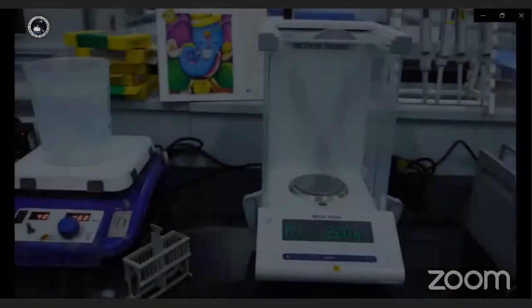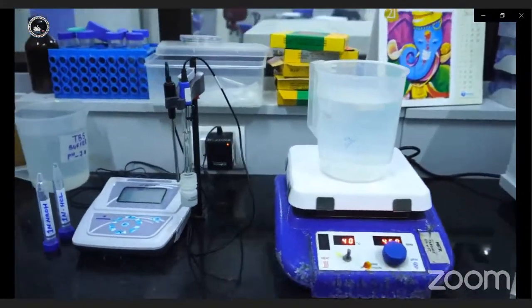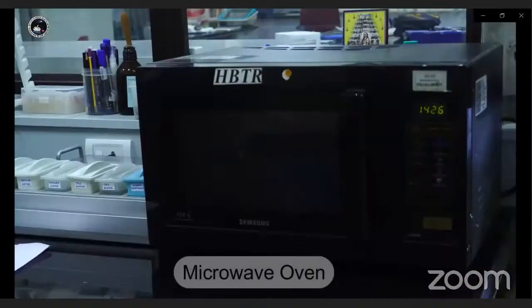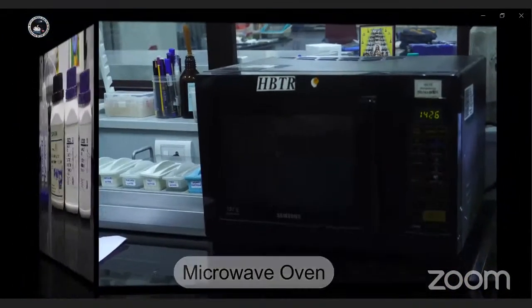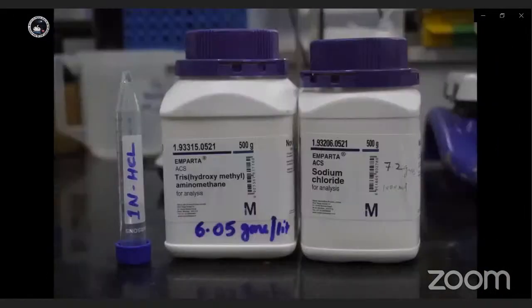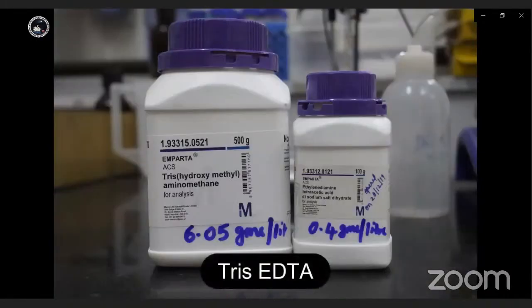The instruments required are measuring balance, magnetic stirrer, pH meter, pressure cooker with hot plate, or microwave oven. Reagents used are phosphate buffer saline and tris buffer saline, which are used as wash buffers, and antigen retrieval buffers, which include citrate or tris EDTA buffer.